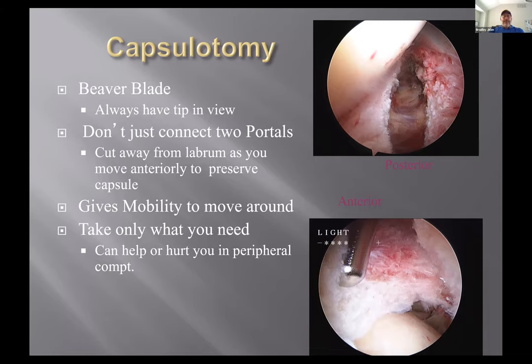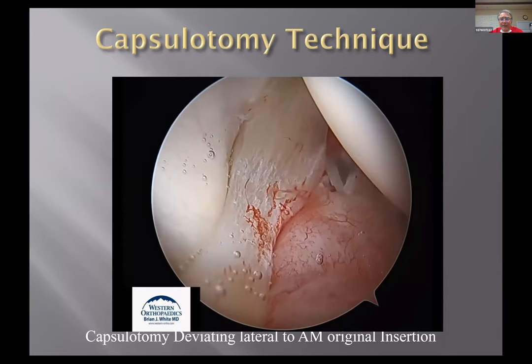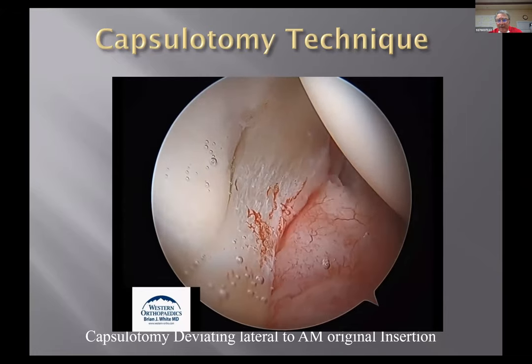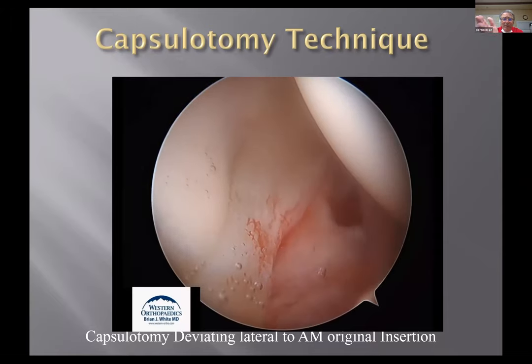But you have to be able to see what you're doing. You have to be able to get in. Again, the labrum's on the left. When you do your capsulotomy, what you want to do is leave enough on the acetabular side that you can get a suture in it to repair it. So you don't want to be cutting right next to the labrum. You see we're diverging a little bit away.